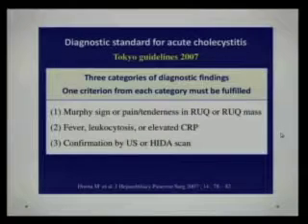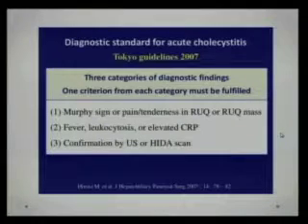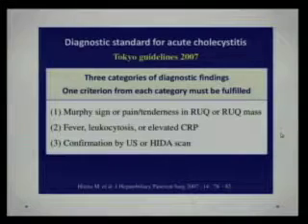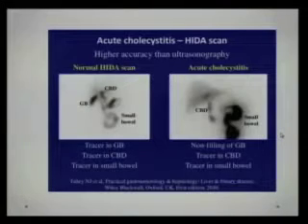As I have mentioned before, if a patient has at least one gallbladder calculus and a positive sonographic Murphy sign, with confidence, 95% of the time that patient does have acute cholecystitis. We need to remember that. There may be no gallbladder wall thickening, no pericholecystic fluid, and no gallbladder wall hyperemia. A positive Murphy sign with at least one stone is diagnostic for acute cholecystitis.